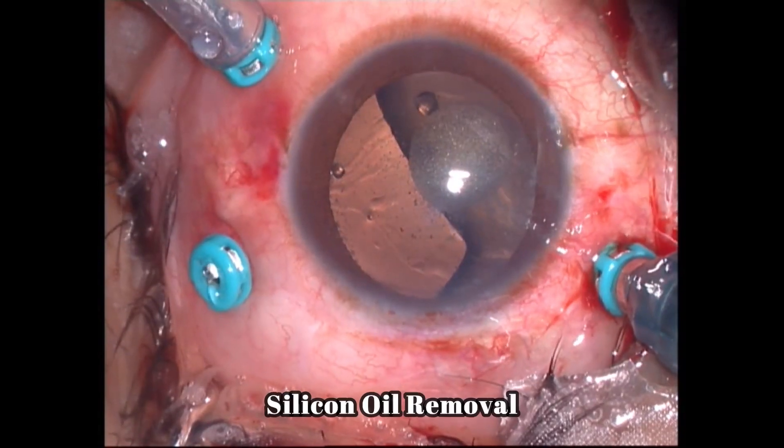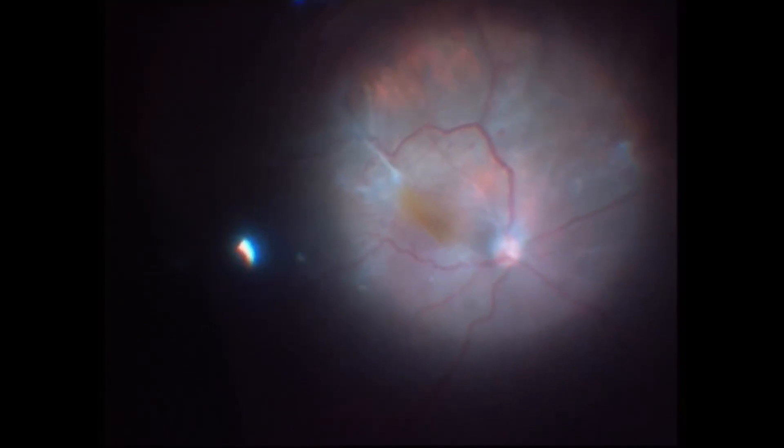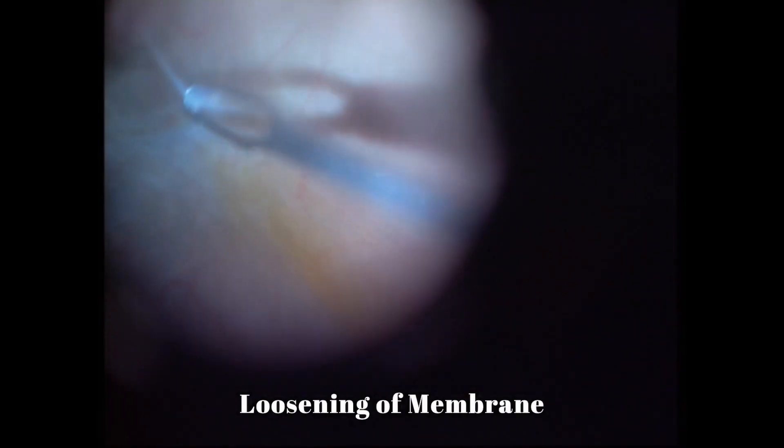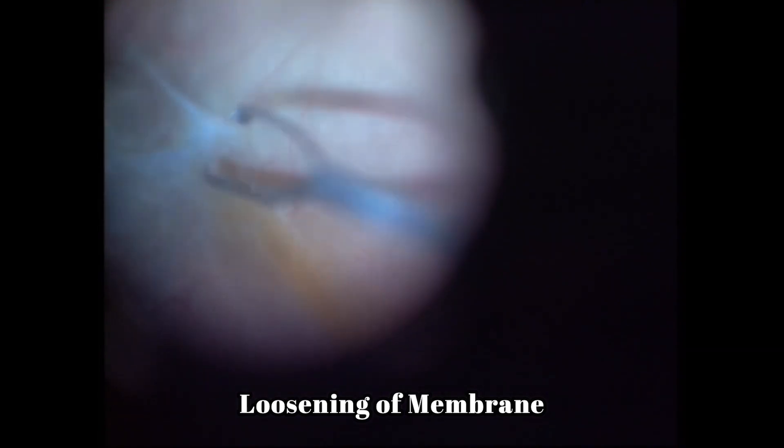Next is a case of taut epiretinal membrane in a case of a silicone-filled eye. Once again, oil is removed and then the retrosilicone membrane is gradually peeled off.